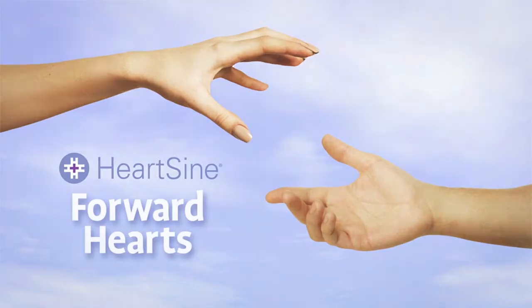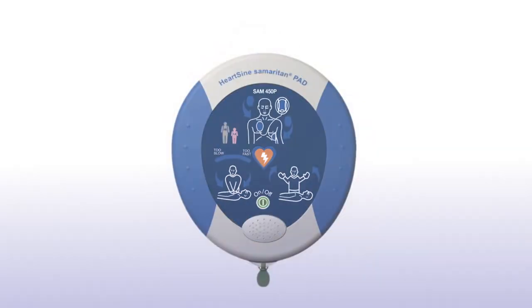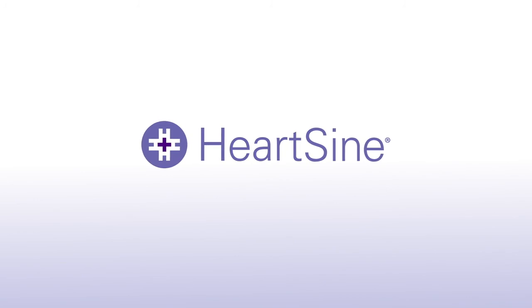With the unit nearby, you are always prepared to respond in the event of someone going into sudden cardiac arrest. HeartSine — life-saving, pure and simple.